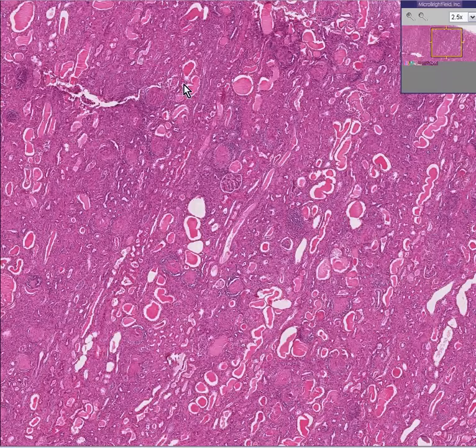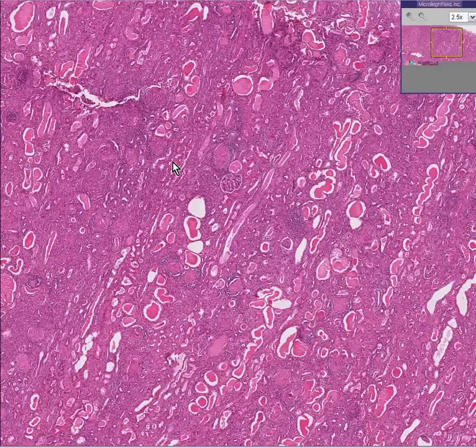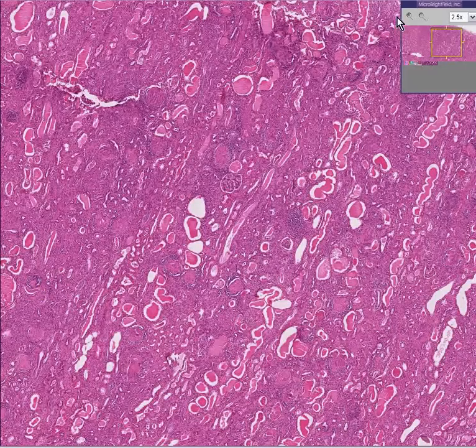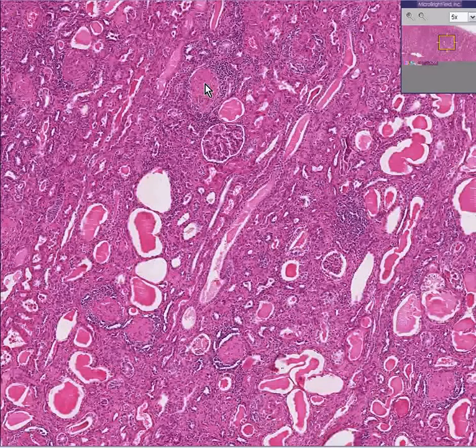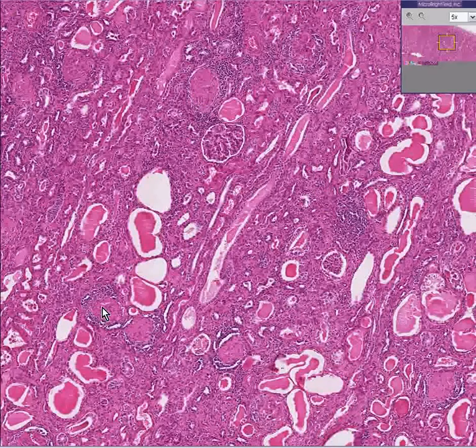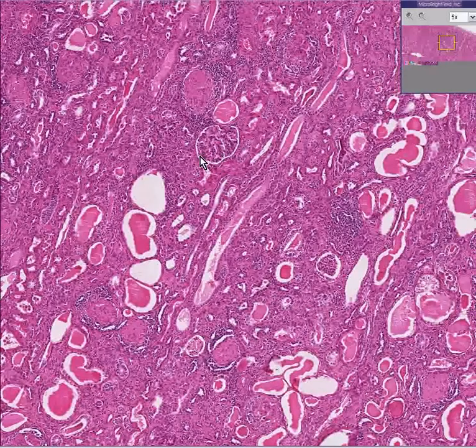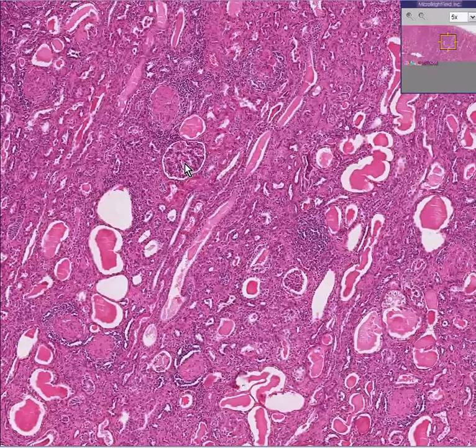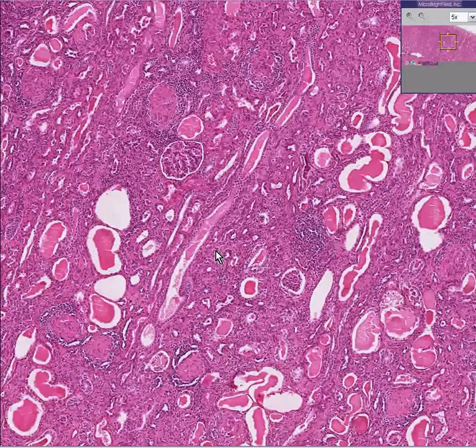Notice in this field you could instantly see at least two or three relatively nice glomeruli, but most of the rest are barely recognizable. They're largely replaced by either fibrous tissue or inflammatory cells, and it doesn't matter what the primary glomerular disease was.